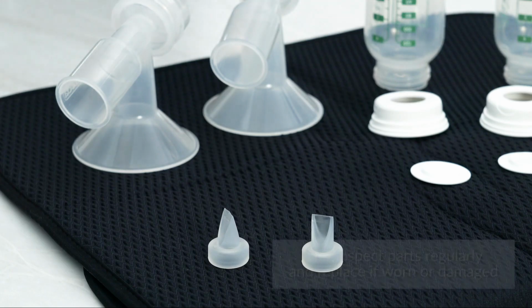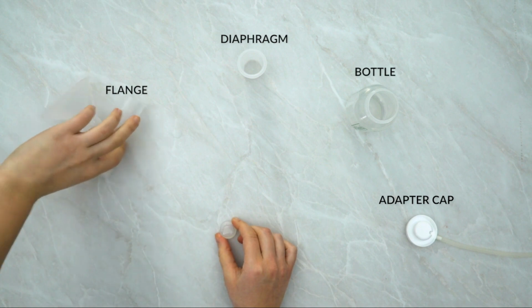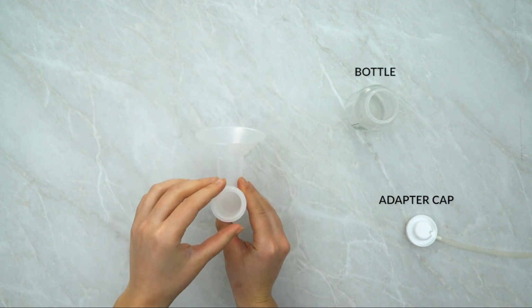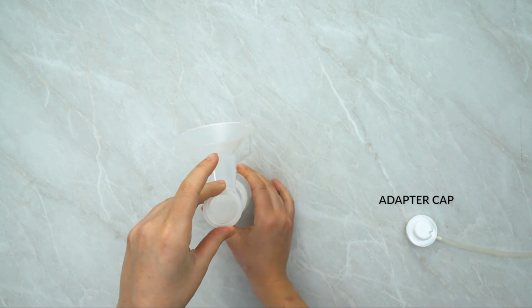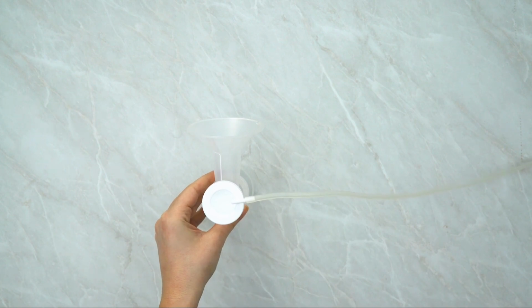Only use the diaphragm and valves that come with the Mya Joy Plus pump. To assemble, hold the valve by the flat edge and compress lightly. Gently push the valve onto the ring on the bottom of the breast flange. Insert the diaphragm into the top of the flange, then tighten the bottle onto the bottom of the flange. Snap the adapter cap by pressing it onto the top of the flange until you hear a pop.